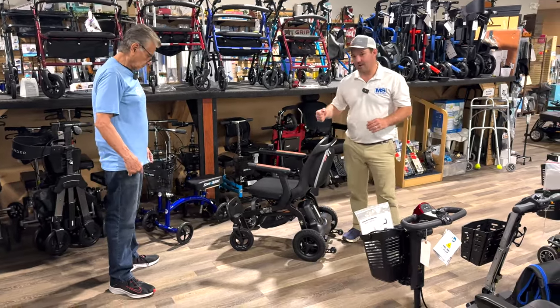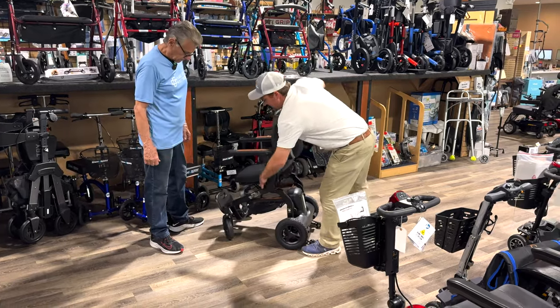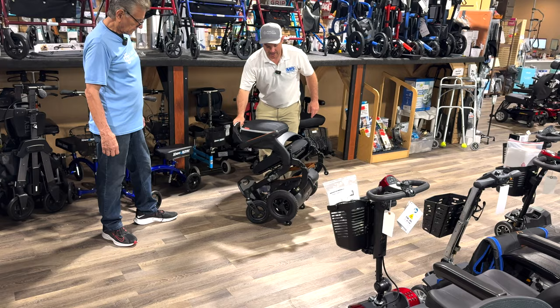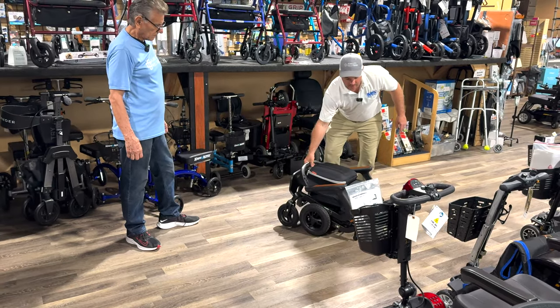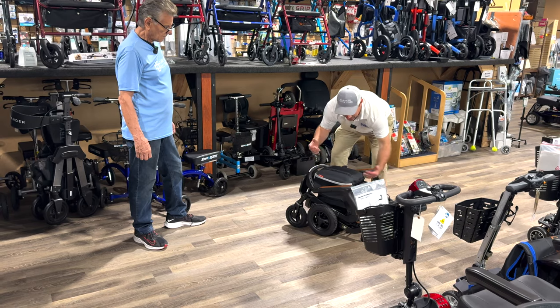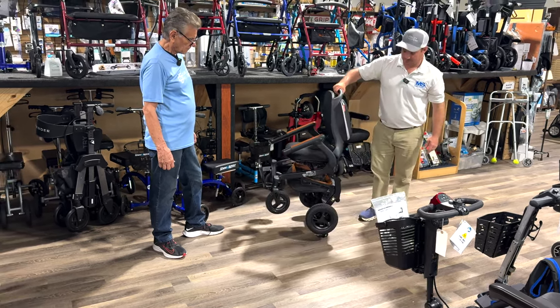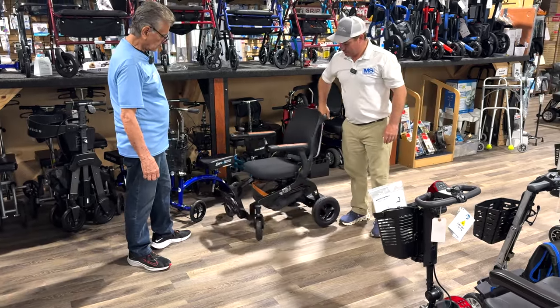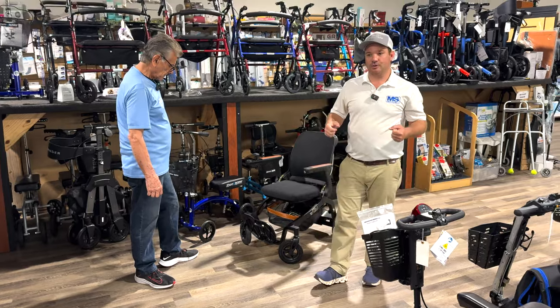It kind of scares you at first if you're not used to it, but the way that they designed this, you can kind of walk to the front to do it, then it's locked, so when you pick it up, it doesn't unfold. Just push that down and watch. It's kind of here, so you're not really having to pick it up.